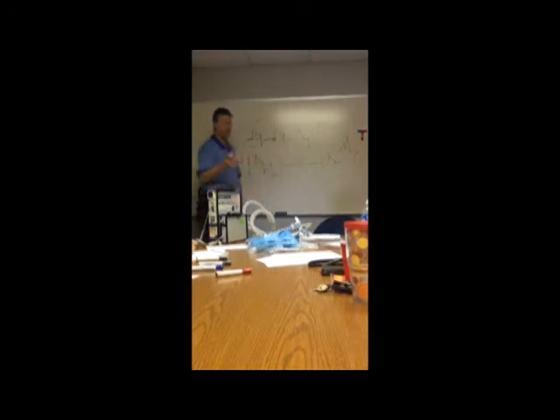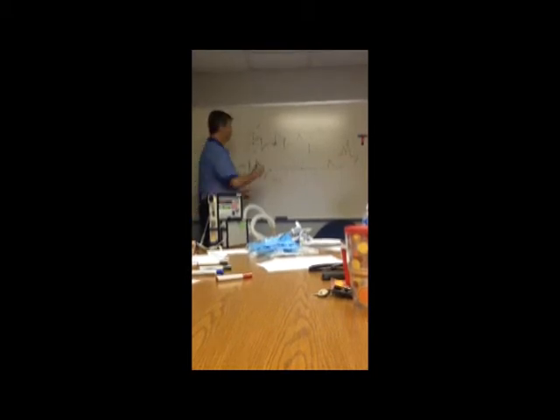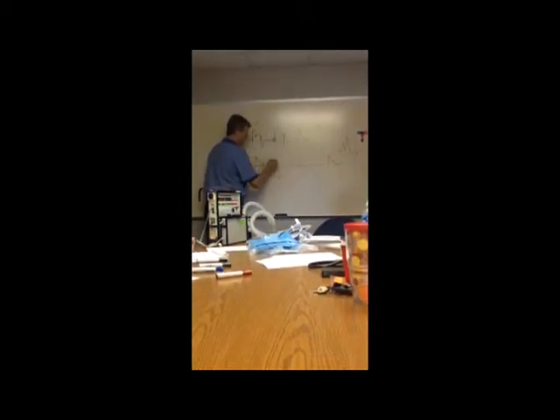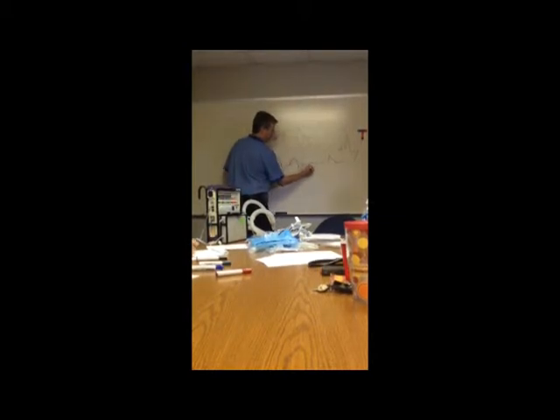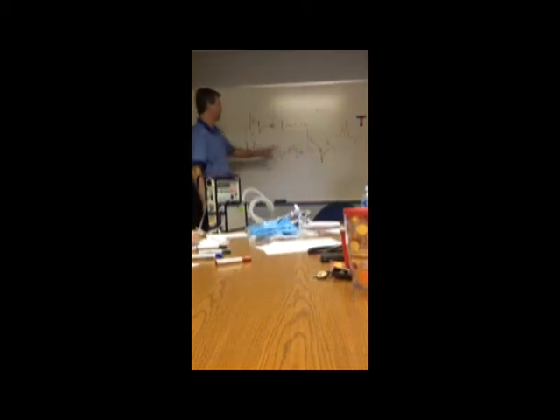Say the patient's breathing 14 times a minute. Those other 6 breaths are going to be spontaneous breaths, which means in IMV, they start when it happens and they stop when it ends, which is unlike any of the breaths we've talked about before. So the patient may start the breath, and it looks a little different than a machine breath. And then it ends, and they exhale. And so they get another breath, it ends, and then they exhale. And then they're not trying to breathe here at that mark. The machine's going to give them another machine breath.